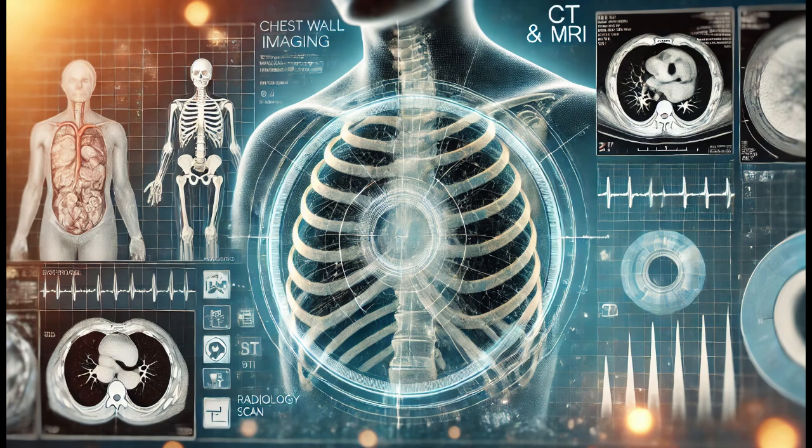special type of CT scan called a CT angiogram, which basically means we inject a dye into the bloodstream that helps us to see the blood vessels more clearly. And it can help us to see if the ribs are compressing the vessels. That makes sense. So we've talked about things that people are born with.